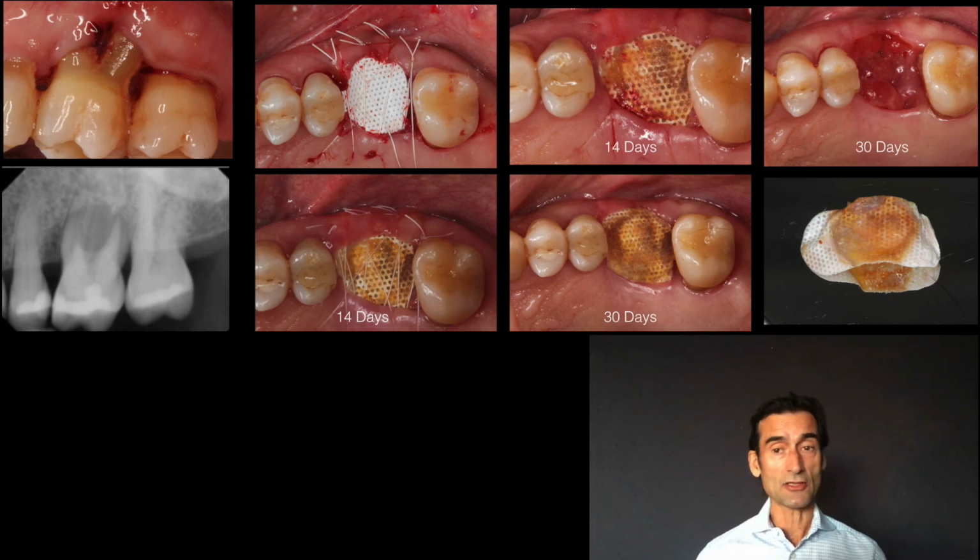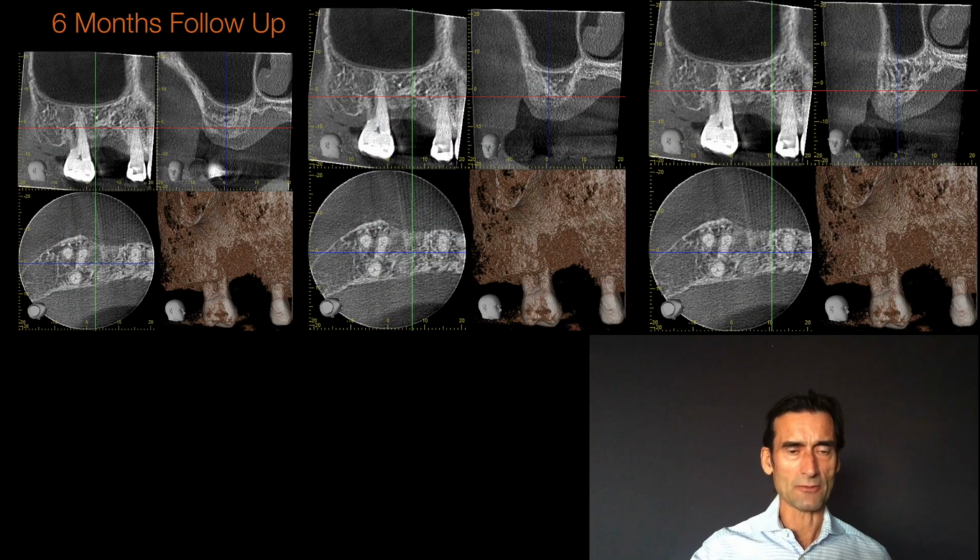At 30 days, you can see the gingival margin is really very stable, in the same position. And then we just took a plier and pulled it out. And you can nicely see in this last photograph where the bacteria were sitting on top, and this was in a tunneling site, how clean it is underneath the tissues. And here is the new osteoid tissue, also some granulation tissue at the top, and this will just granulate in for the patient.